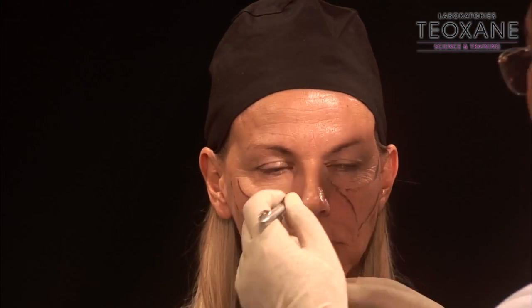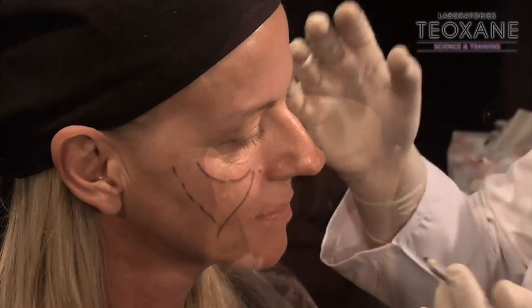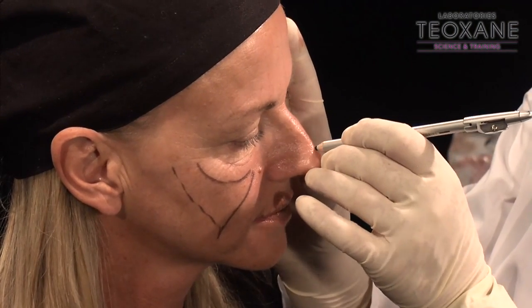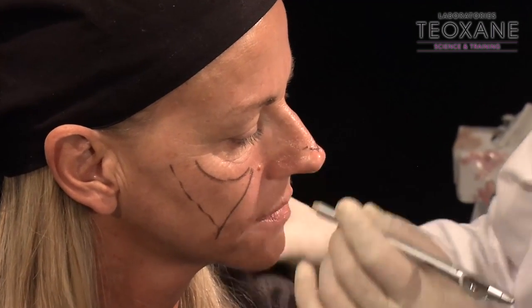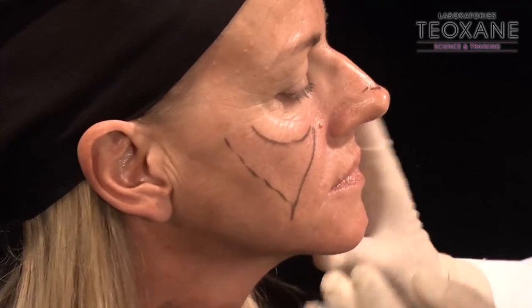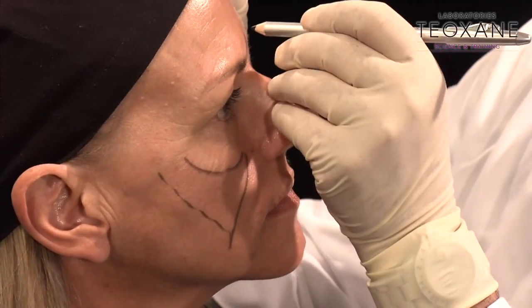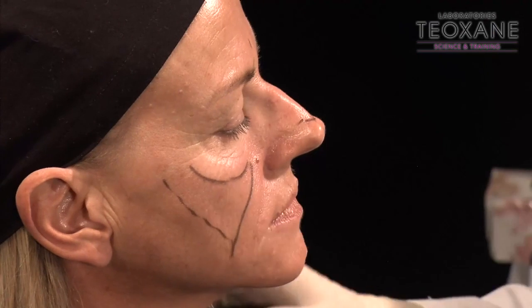I've been told to show you to do some injection on the nose. She doesn't have the real appropriate nose to be corrected because it's an excess of cartilage she has. It's not like a lack of something. She's an excess. So adjusting on some excess is always a bit tricky. I don't like to do it too much. But I'm going to put 1 or 2 drops to show you, to adjust. She lost the angle here. The nasolabial fold is correct, absolutely fine. Maybe we can also with the RHA 1 or 2 fill a few lines here.